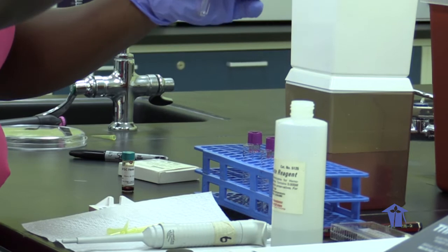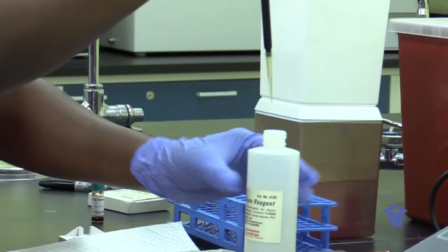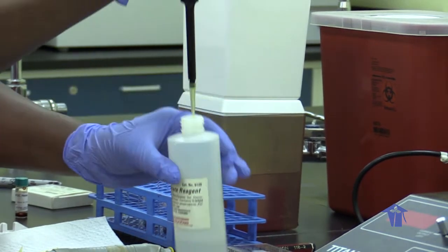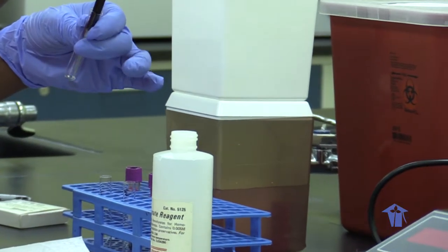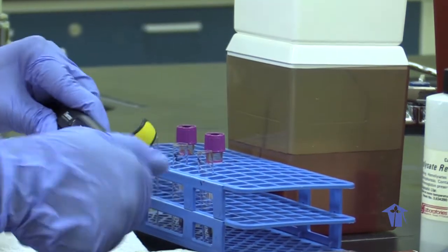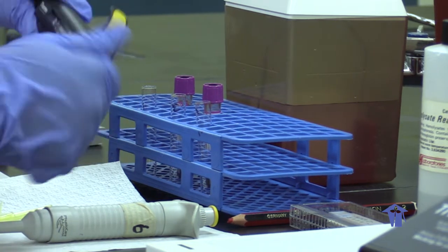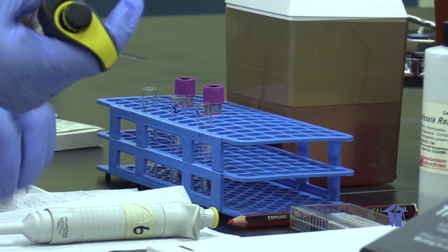So we transfer the hemolysate reagent to our tubes, 75 microliters. And we use our 25 microliters of the blood sample. So 1 part to 3 parts hemolysate.